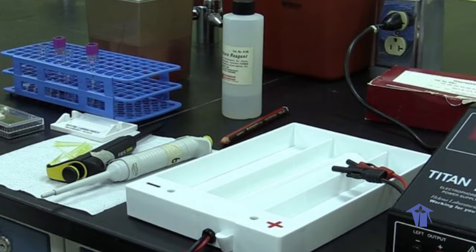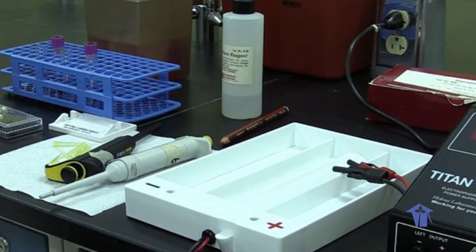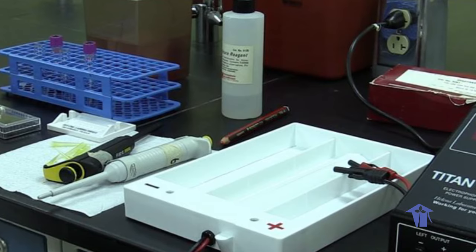It has become the method of choice in many labs, particularly for large-scale population testing, such as neonatal testing programs to determine if the neonate, or the recently born offspring, has any abnormality in their blood, hemoglobin specifically. And we'll have the lab techs again showing you what the procedure is like.